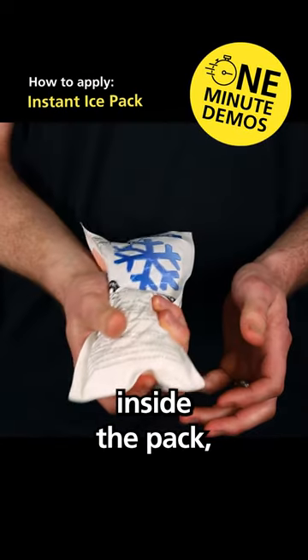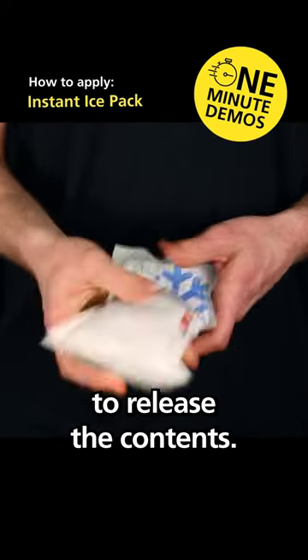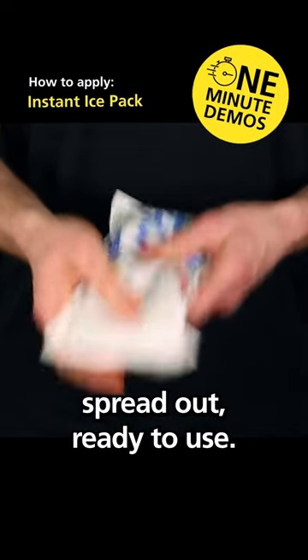Step one: find the water sachet inside the pack, squeeze as hard as you can to release the contents. Shake the bag, get everything spread out and ready to use.